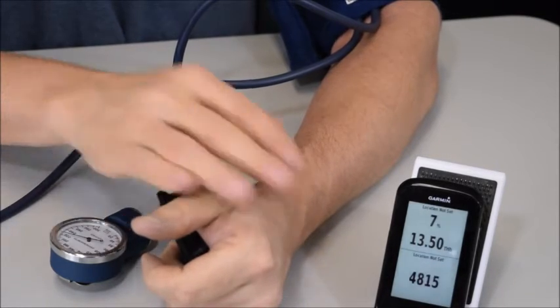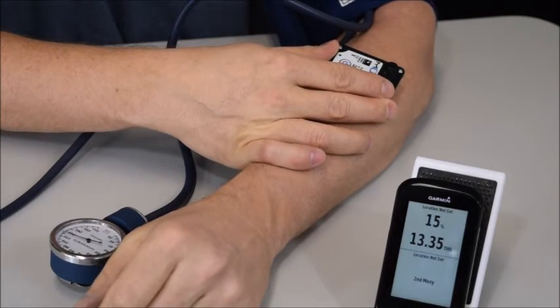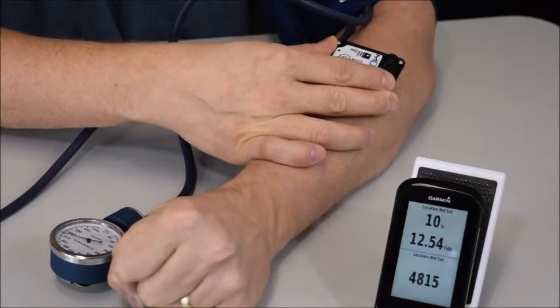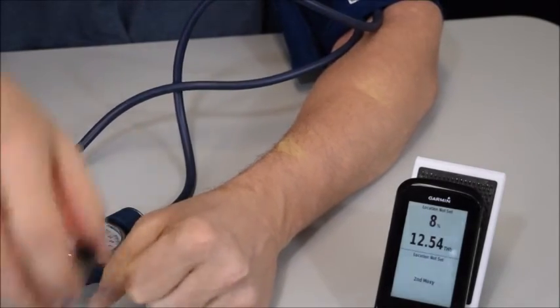And so both on the thenar eminence and on the forearm, the Moxie is showing what I would call really low numbers. We're getting down into the tens and the single digits. And this is what you expect in this kind of occlusion. If we wait long enough, we can probably even get it to go down to 0. But then we're going to go back and take a look with this competitive device here.